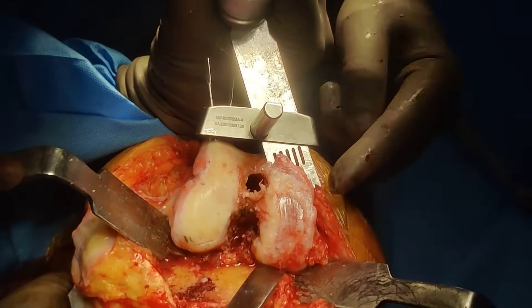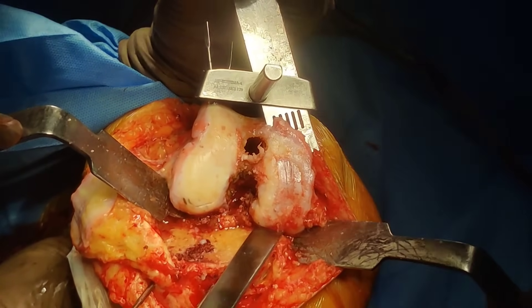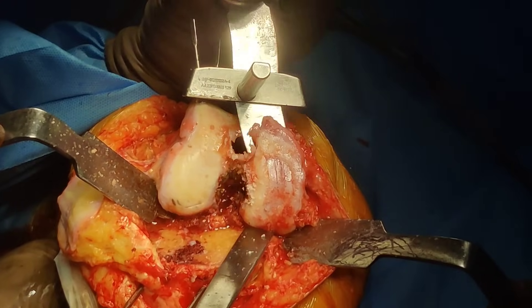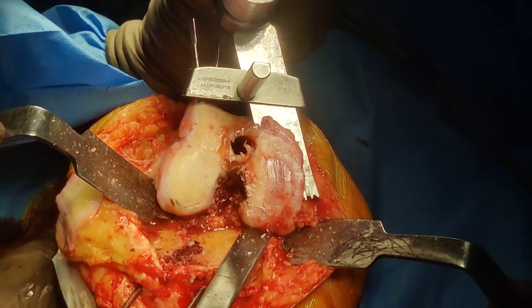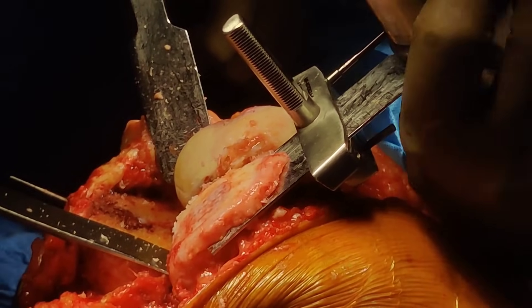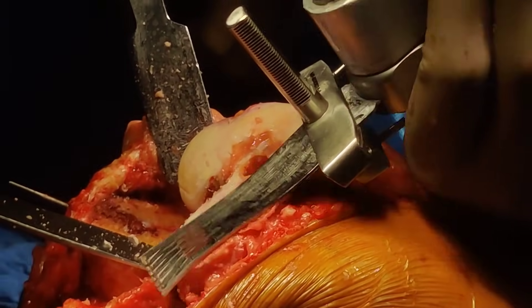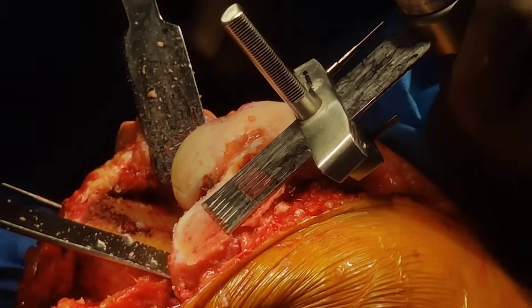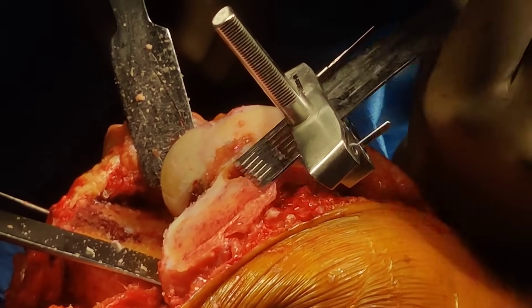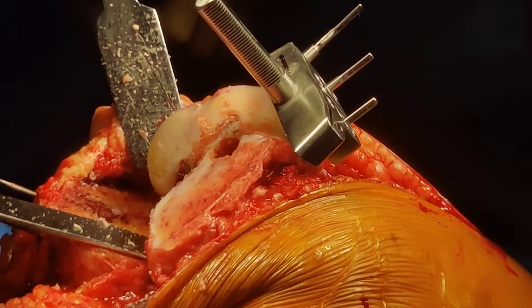Notice I'm coming out here first — you need to come out here first. Don't start from inside and go out, as you will cause bone loss. Start from outside. While sawing it is important to go full speed and not bend the blade either way — it should go nice and straight. If you go straight you will not hear any resistance; as soon as you angle, the sound will change. Nice and smooth — that's perfect.